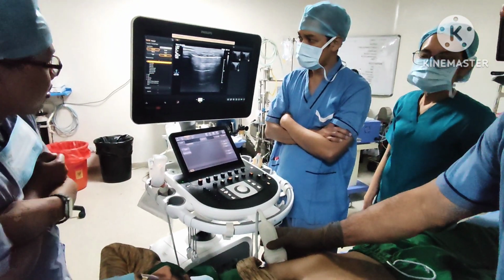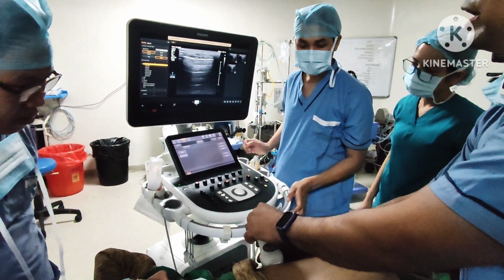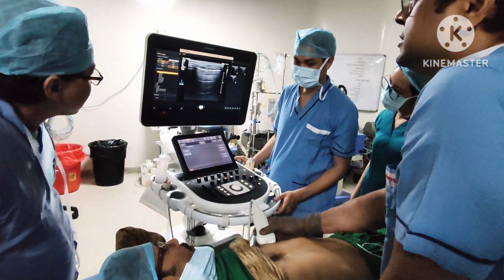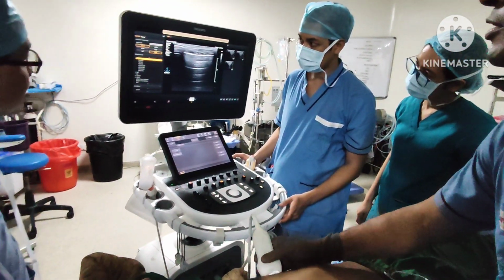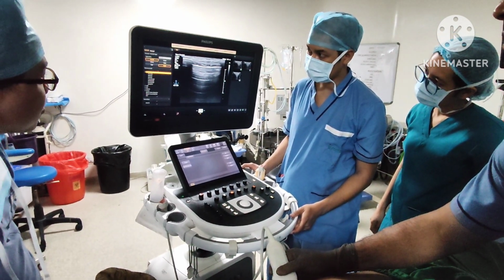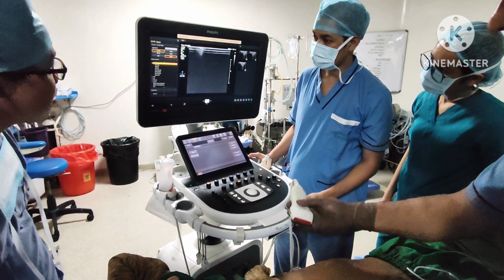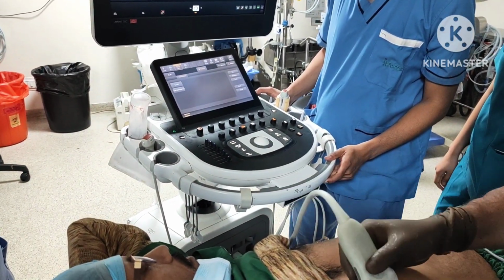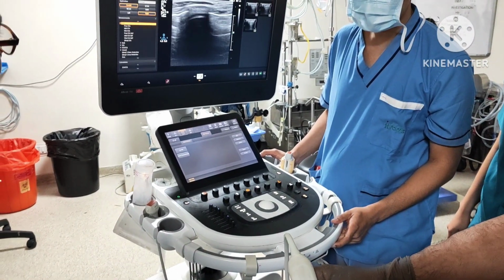Yeah. So what we are trying to do now is look at the lung, right? This is how the normal lung looks under ultrasound. What I'm using over here is a linear probe, a 12 frequency probe, and you can place it anywhere on the chest and try to get an image like this.